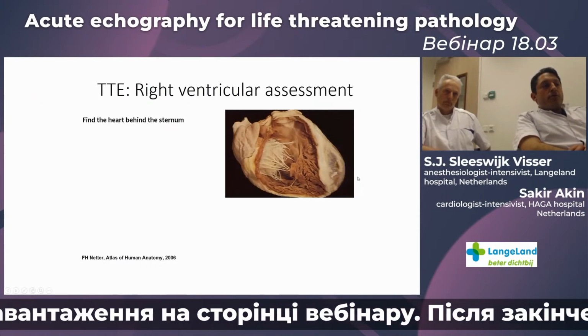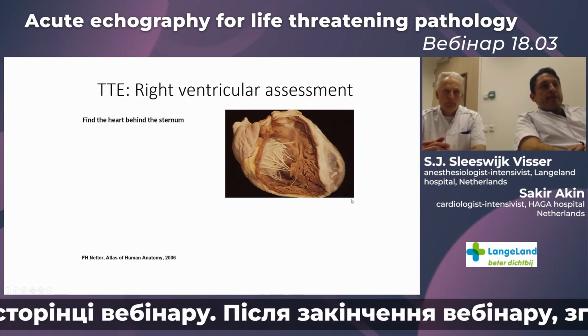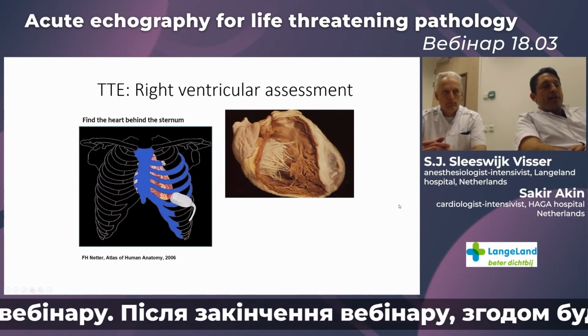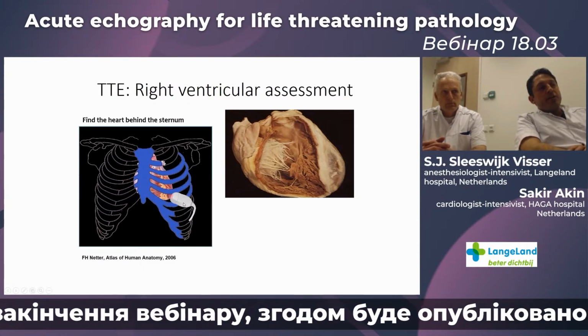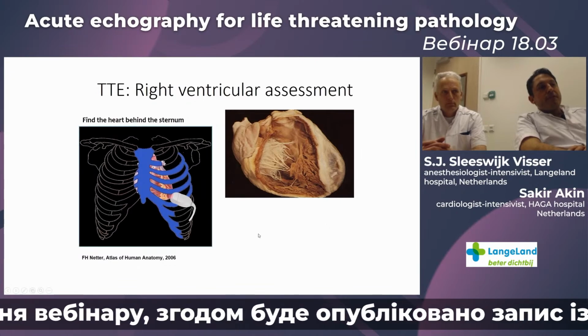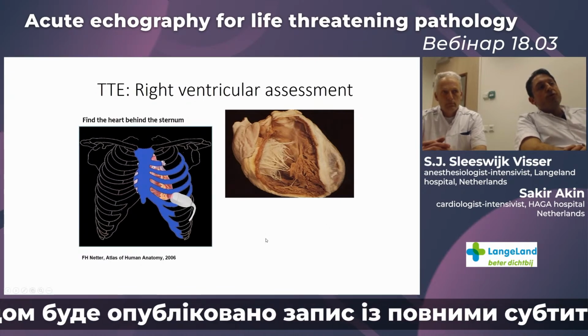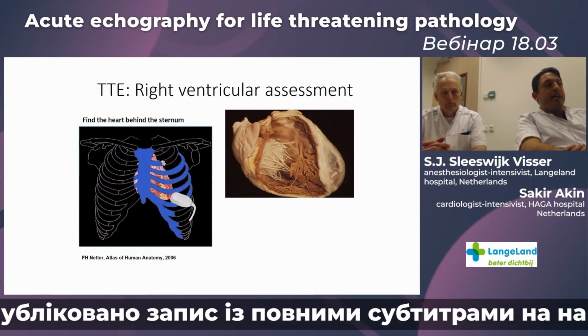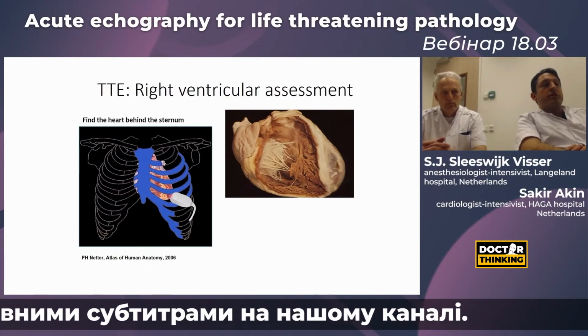If you want to assess the right ventricle thereafter, dedicated, you have to go further on apical view to see the ratio first of the right ventricle and the left ventricle, and the anatomical differences between those 2 ventricles of high and low pressure areas.